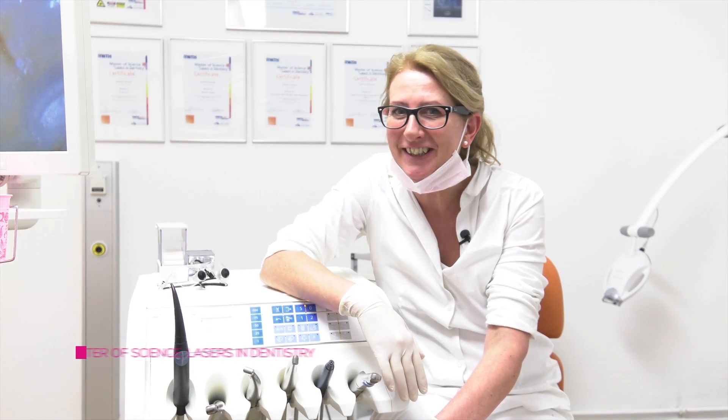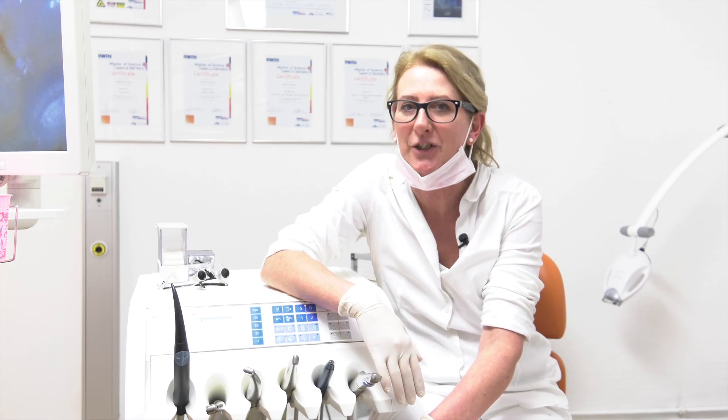Hello everybody, it's me, Janet, again. Today I show you a tooth filling at the posterior tooth and I show you the advantages of laser preparation.